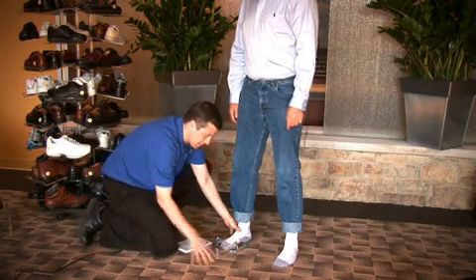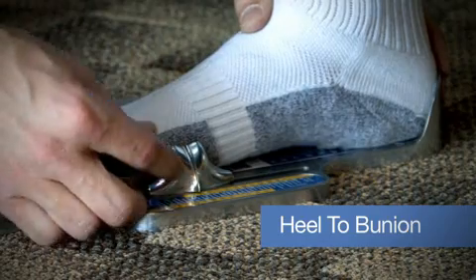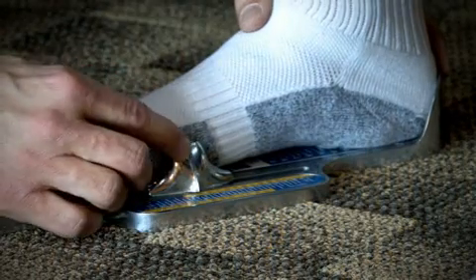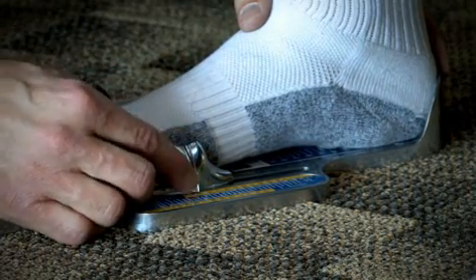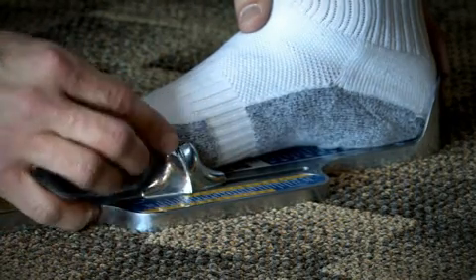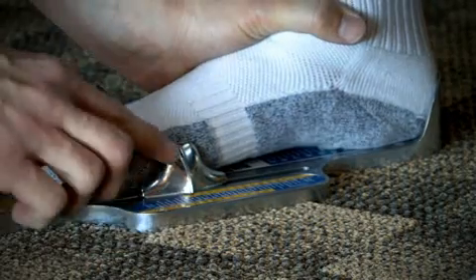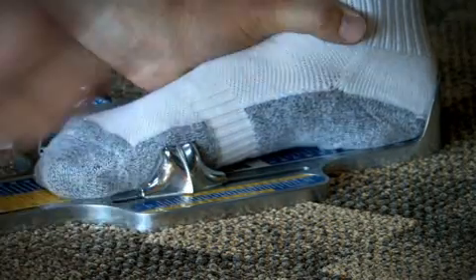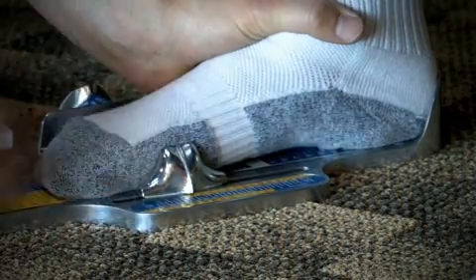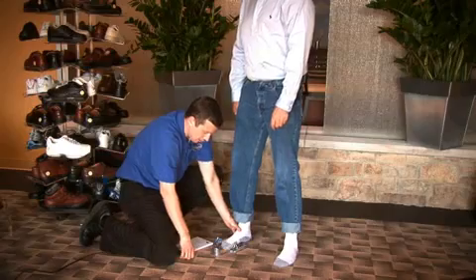Then we'd go to the next measurement, which is heel to bunion or heel to the MTPJ. In this particular case, this little sliding bar has an indicator to show exactly where the centered portion of that bunion is. Once we've centered that and he's seated properly in the heel cup, I notice he's approximately a 10.